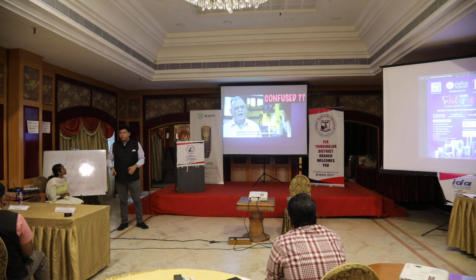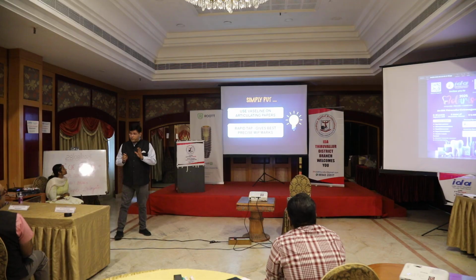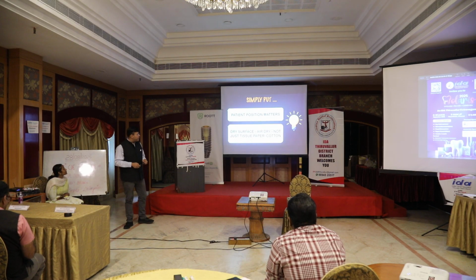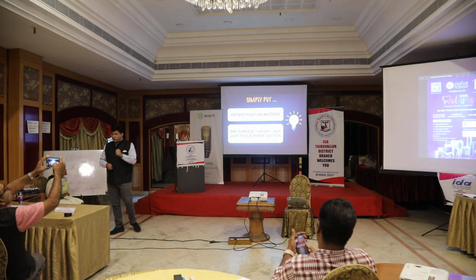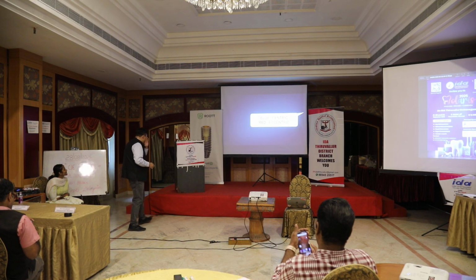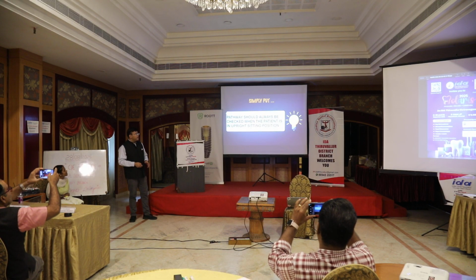Now just to conclude, another 3 or 4 slides, what am I basically trying to tell you? Use Vaseline on articulating papers always. Rapid taps will give you best and precise tapping marks. Position of the patient is very, very important. Always air dry. Do not depend on anything else. Air dry the teeth. Blue use for centric, red for eccentric.